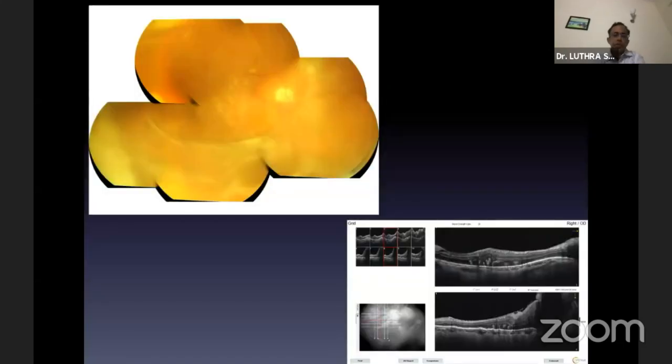So, to end my presentation, this is the last video I have to show: in choroidals you also get very bad PVR. So this was a case of bad PVR, recurrent RD. So how I managed with the silicone oil in situ, you can see that a lot of membrane peeling was required. So I did it with silicone oil in situ because it helps to act as a third hand and keeps the retina pressed, giving counter traction for membrane peeling.